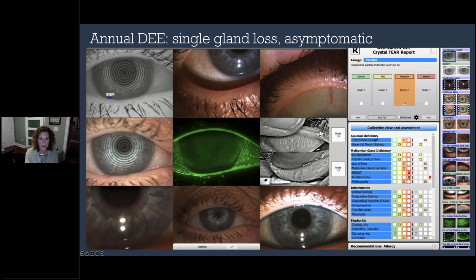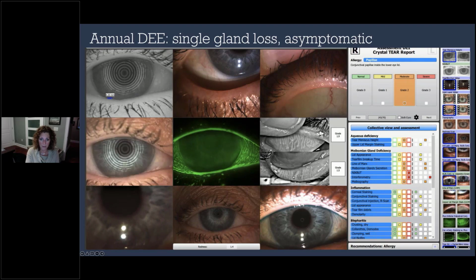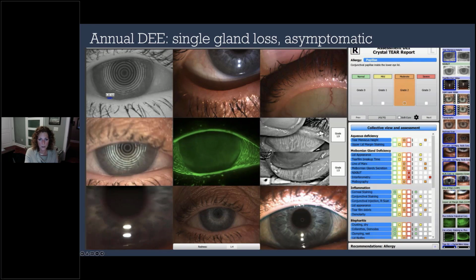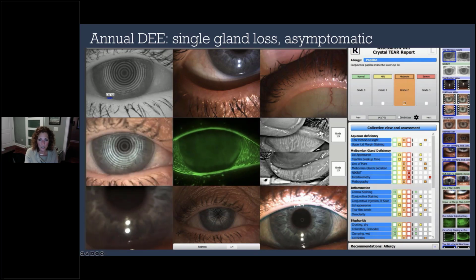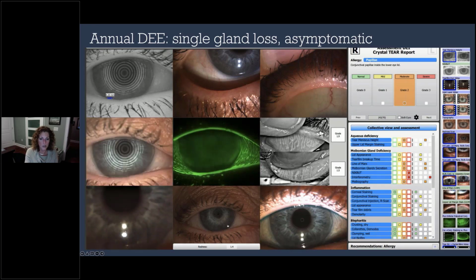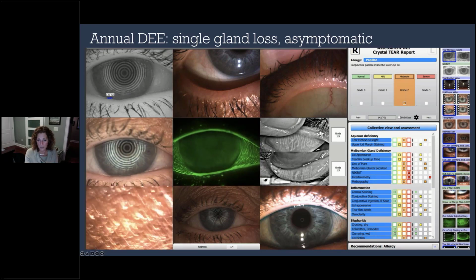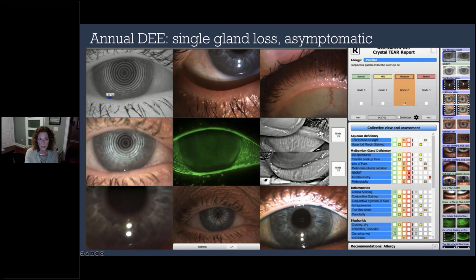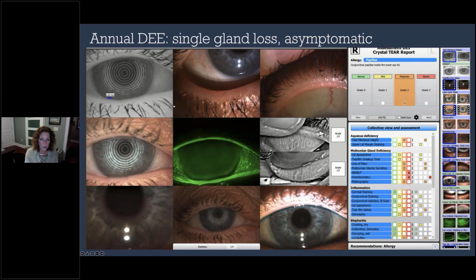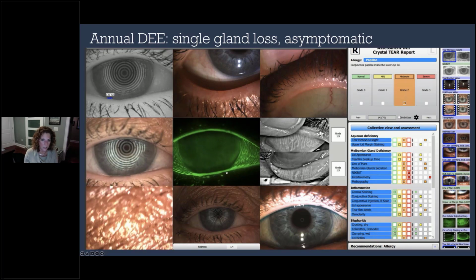This is her annual dry eye eval. However, on each lid, I lost 1 gland. Now, this bothers me, right? I don't want to lose any glands. She has plenty, which is great, but what was my recommendation to her? I showed her the old and the new and showed her that she lost a gland in a year. Showed her that our inflammation was under control, but that we have to do something here. So we're scheduling a thermal evacuation to get better movement, because you see here the oil is not coming out on its own. Even when a patient is asymptomatic, even when they're well controlled, this is a beautiful tool in helping them see it and know, all right, I do need to do something.